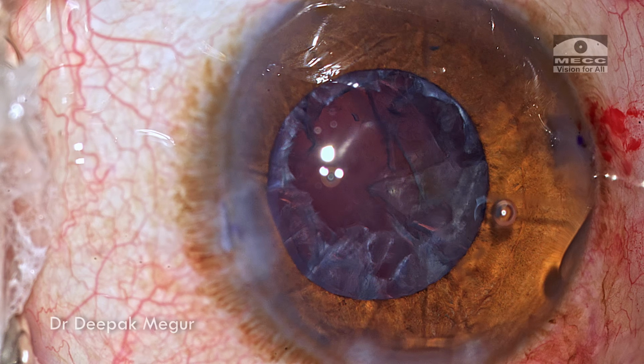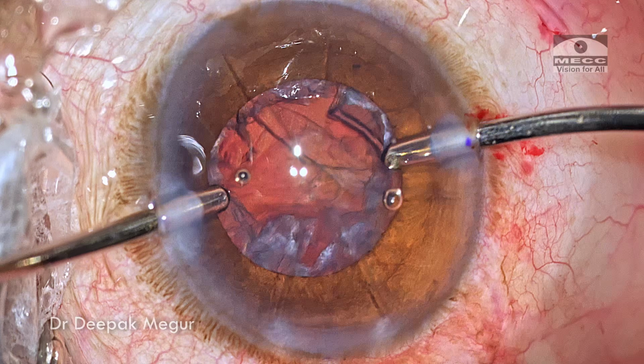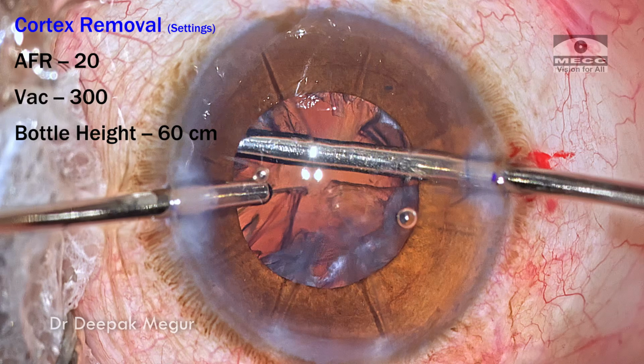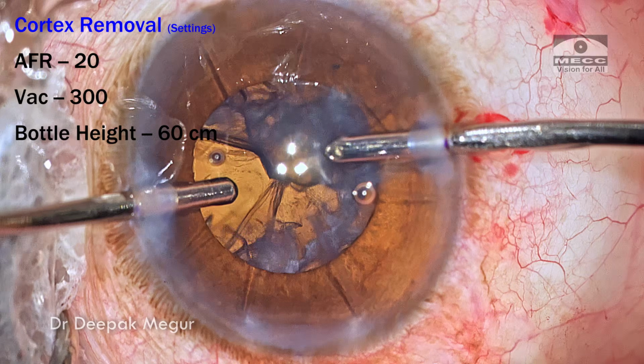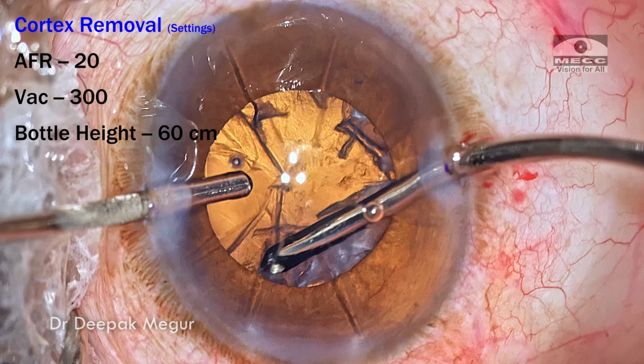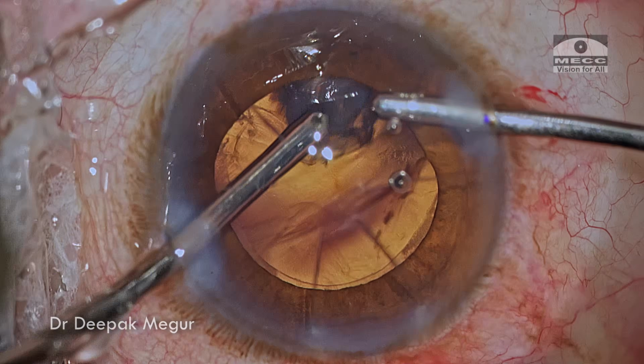So, time to remove the cortex. Again, this principle of low pressure surgery is being followed here. Again, the bottle height is maintained slightly lower than what I usually do. And again, to compensate for that, I'll be reducing my flow rate and vacuum just to ensure that the chamber stability is not compromised.